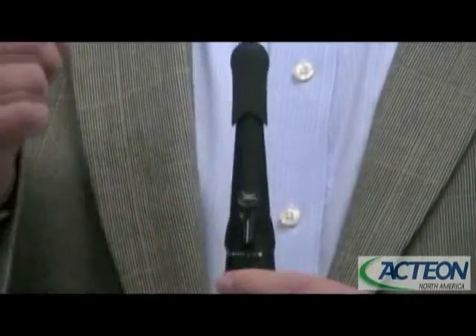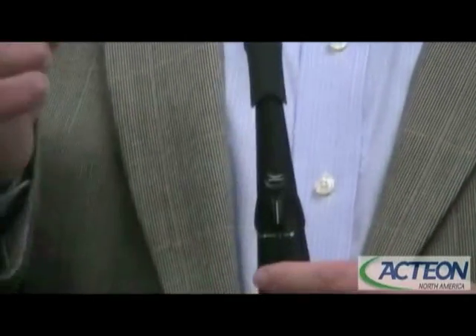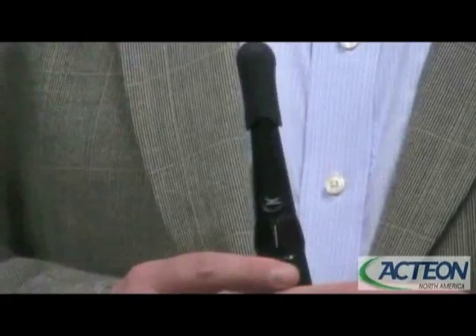The SoProLife, because it is a high-end intra-oral camera as well as your caries detection and treatment aid, is going to be a device that aids you in your practice by not only helping you with patient education, but case acceptance is going to go up, as well as being able to document for your insurance companies.